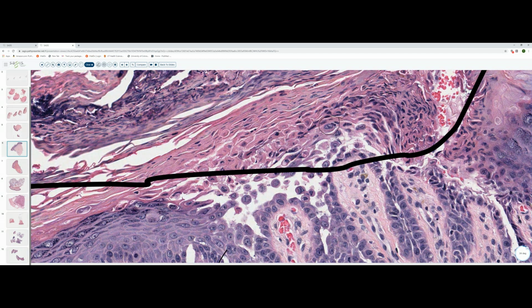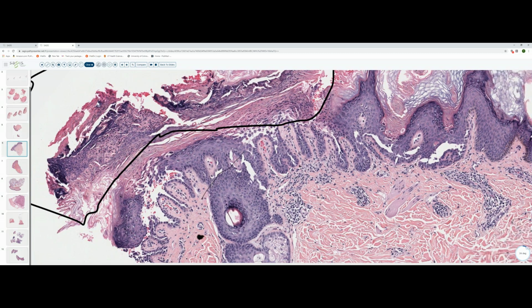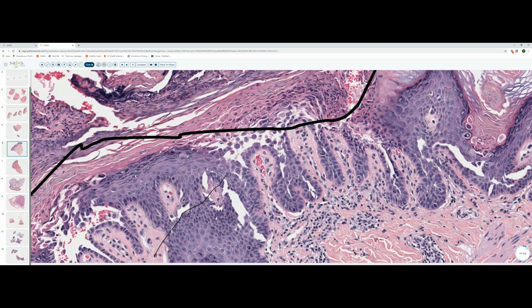The keratinocytes that have become acantholytic are beginning to undergo premature keratinization. Their cytoplasm is becoming bright pink, and the nuclei are becoming apoptotic. So what we have here is a reaction pattern that we term focal acantholytic dyskeratosis. We've got this split in the epidermis containing acantholytic, or rounded up, cells which are dyskeratotic.